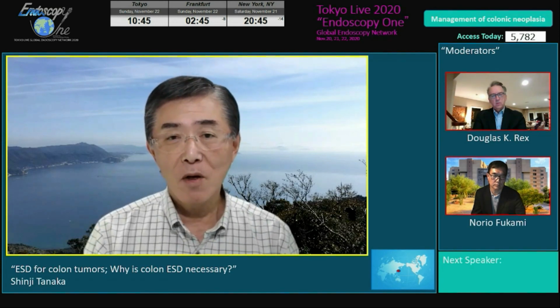Right. Shinji, any comment? Incidence of submucosal invasion is very important. However, we have magnification, EUS, various accessories, so we can diagnose exactly the SM invasion. So pre-diagnosis prior to endoscopic treatment is very important. Using magnification and lesion morphology, we can diagnose exactly invasion depth of tumor or carcinomatous lesion, so we can select adequate treatment method.